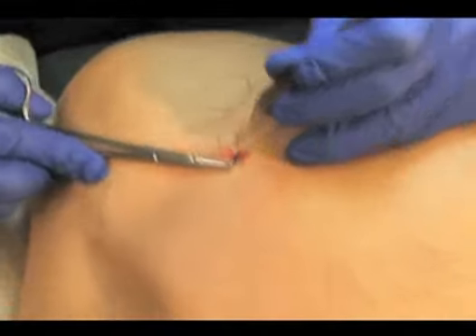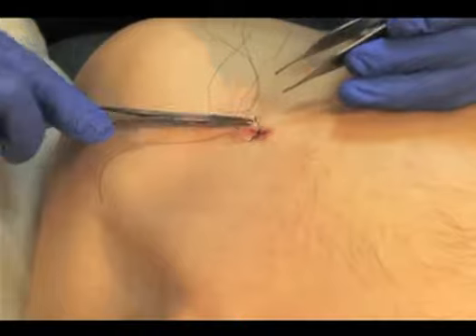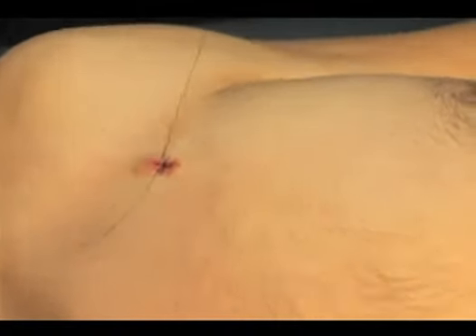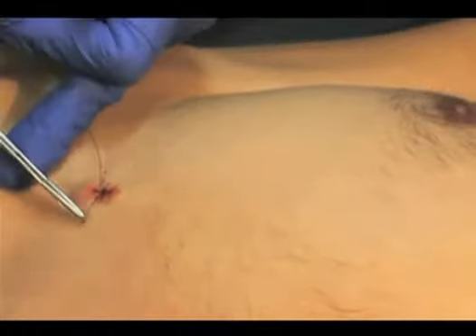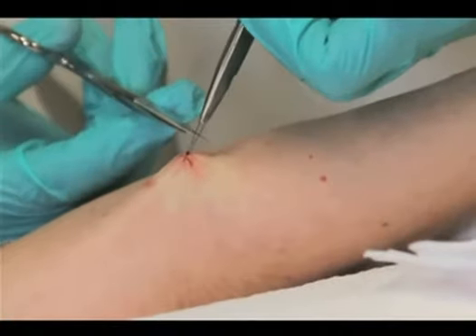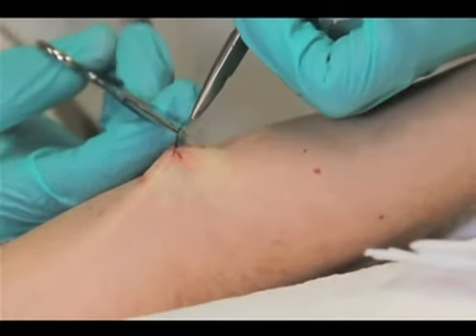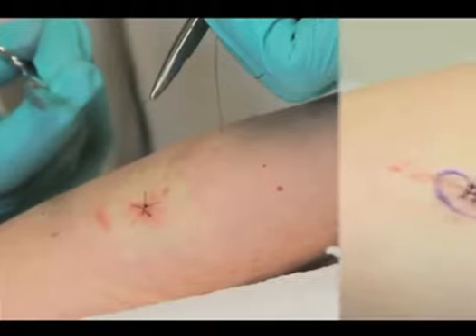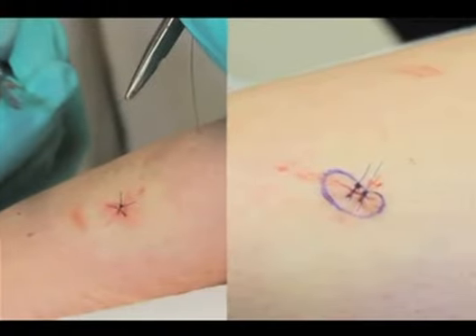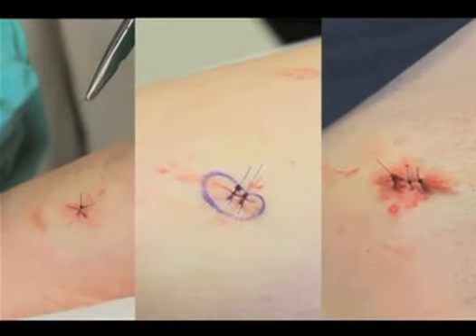If a second suture needs to be placed, you can pierce the entire wound without going through the center. Place 1, 2, or 3 simple interrupted stitches, depending on the size and location of the defect. For an area measuring less than 3 millimeters in diameter, a single stitch is sufficient. For an area measuring 4 to 5 millimeters, place 2 simple interrupted stitches. Place 1 more stitch for every 1 millimeter increase in size thereafter.